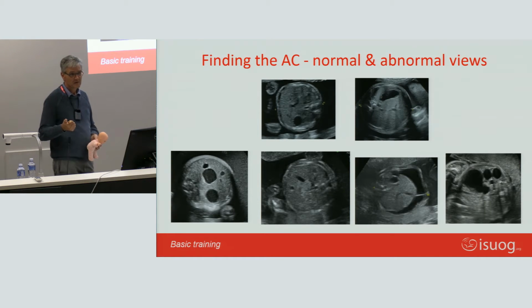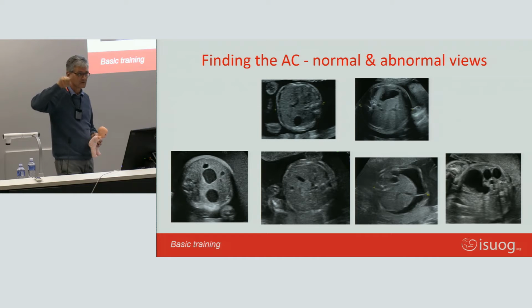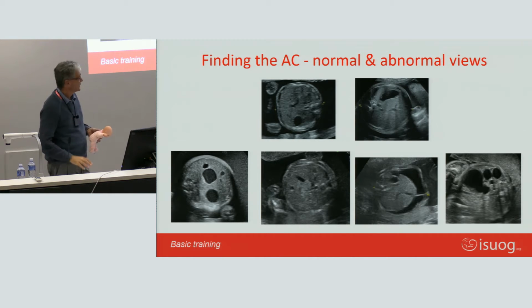Okay, so either the baby's not swallowing, and it can be that it's not swallowing because whatever it swallows, it breathes out because there's a huge tracheoesophageal fistula. It can be that it can't swallow because its neuromuscular connections are shot, and then I would have expected lots more amniotic fluid around it. And the amniotic fluid actually looks pretty okay.